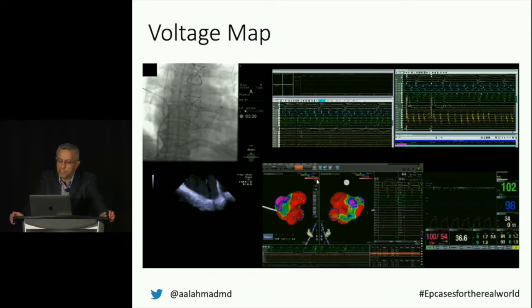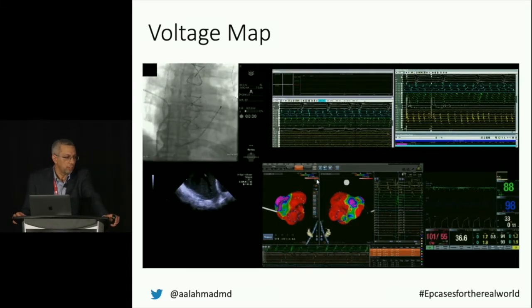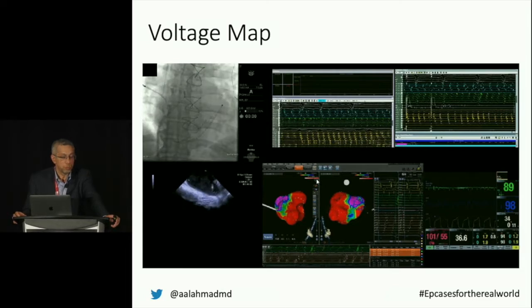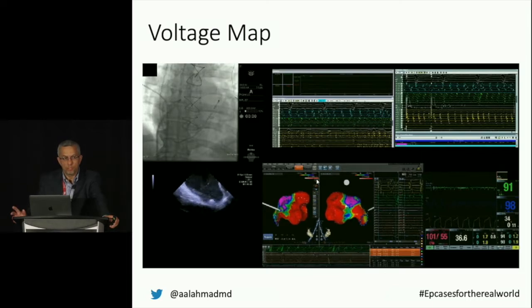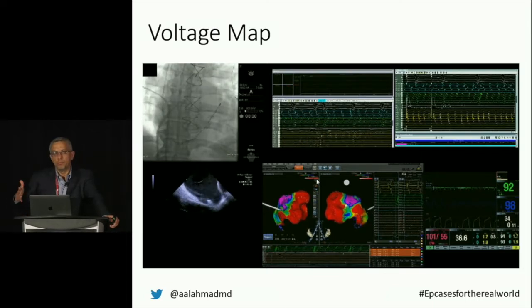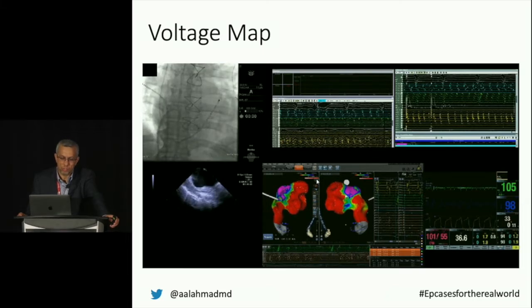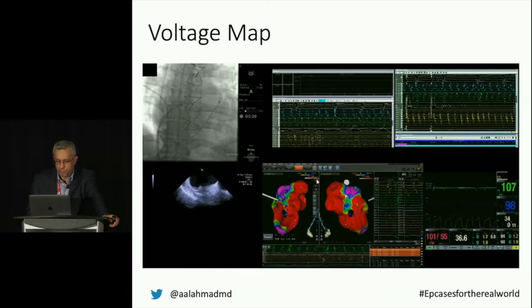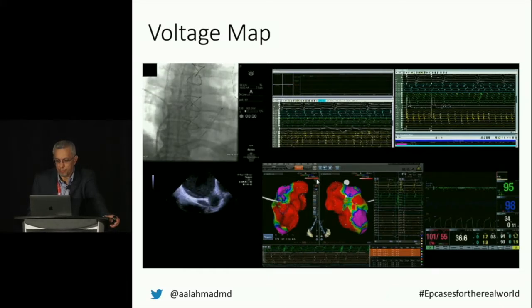In this case, the left upper was not isolated, and the right lower was not isolated, despite a cryo-maze procedure. And whatever ablation was done was fairly ostial or fairly distal in the vein. They didn't really get much of the antrum or the posterior wall. So that was sort of this guy. You can kind of get an idea of the map as it's being built there.